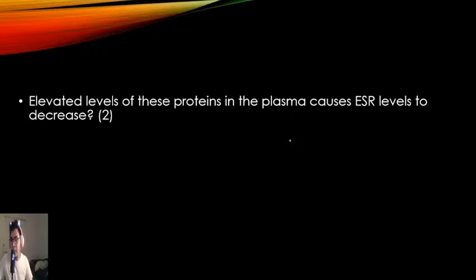Patients with hyperalbuminemia will have a decreased level of ESR, so it could be a falsely decreased or unreadable ESR value. It's always stuck at a 0.